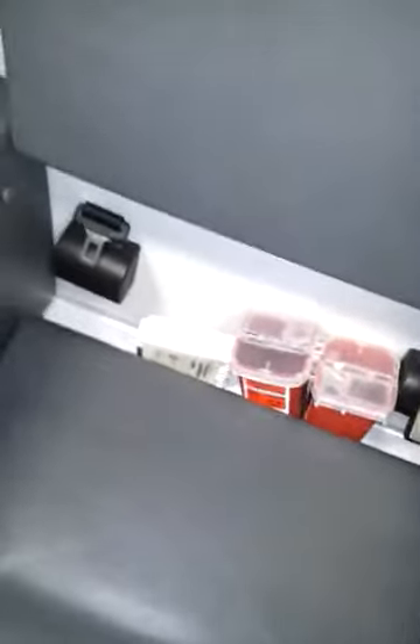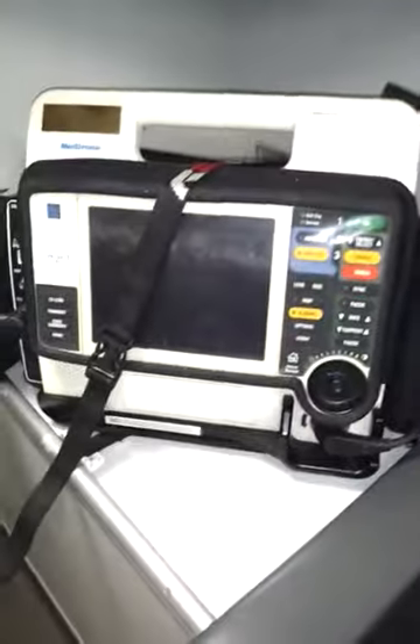This is our portable radio. It's our wall suction. More hotboxes. And an extra battery for our Life Pack 12.